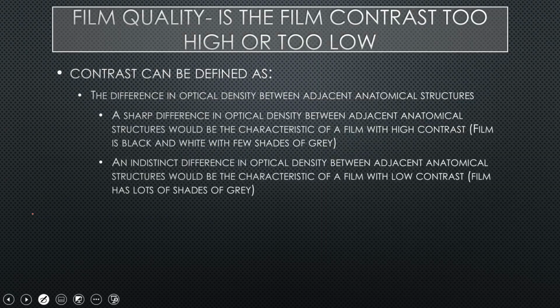Alrighty, next is to consider the contrast. Is the contrast too high or is the contrast too low? So contrast can be defined as the difference in optical density between adjacent anatomical structures. So in little words, are we appreciating enough shades of gray?